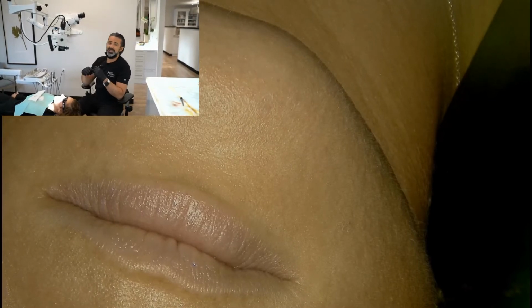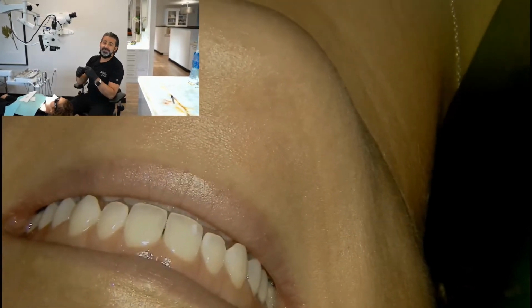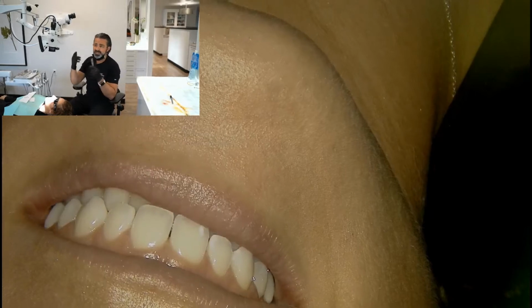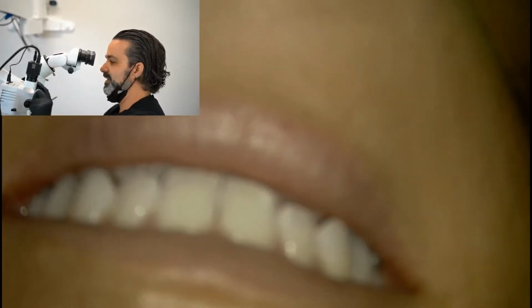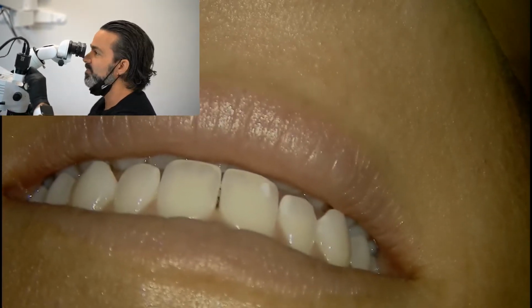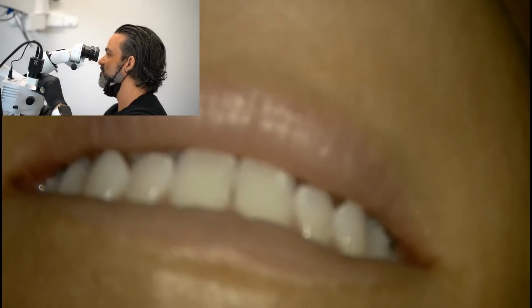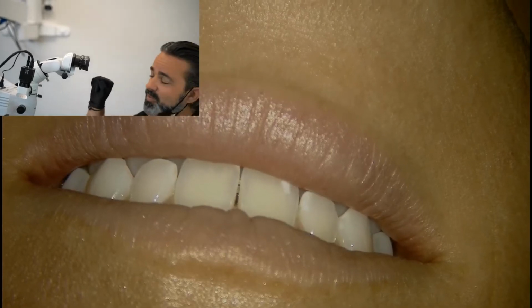Eyelashes, I actually cut my eyelashes, don't tell. I cut them because they drive me nuts. They look pretty, but when you flutter your eyelashes on these lenses, it's just like if you were to wear glasses. That gets a little obnoxious. When you're working under a microscope, sometimes you want to lean in, and then when you blink, you get those wispy lines, and you don't want to keep wiping those, especially while working on a patient.